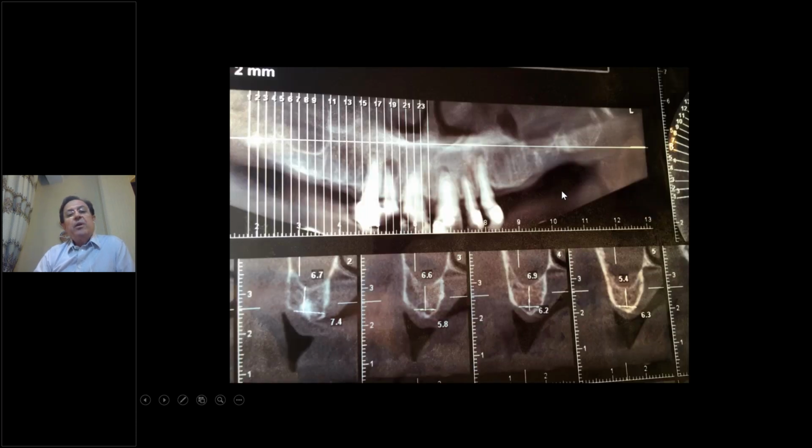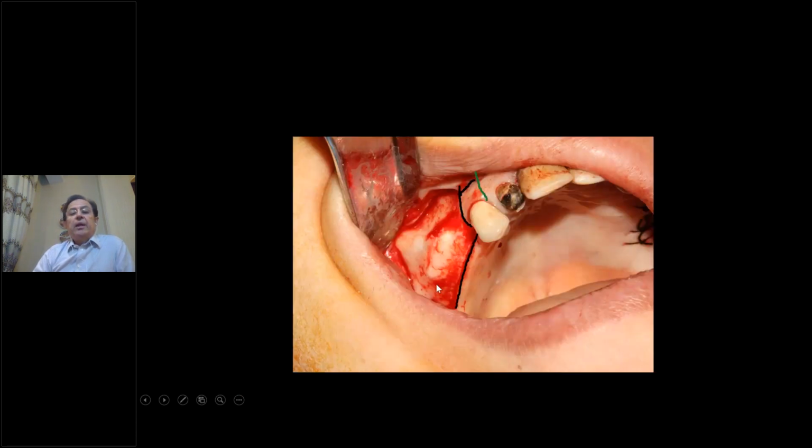In the case where we have a CBCT scan and our plan is to have an open sinus here, it is all about the design of the flap. The flap must be crestal, slightly too palatal, and then we have a releasing incision. As I told you, the incision must pass from the mucogingival junction, but not so much as to cut the extraosseous anastomosis.